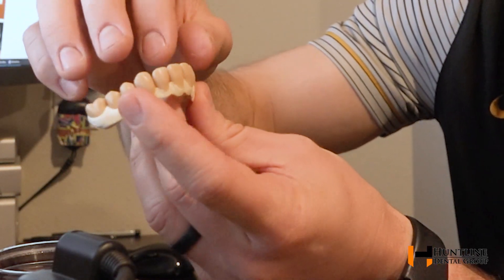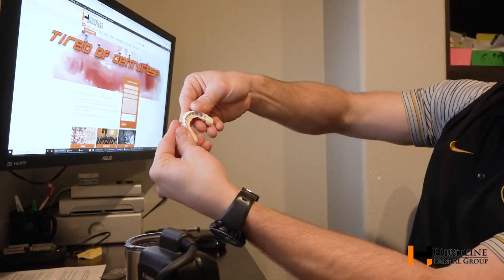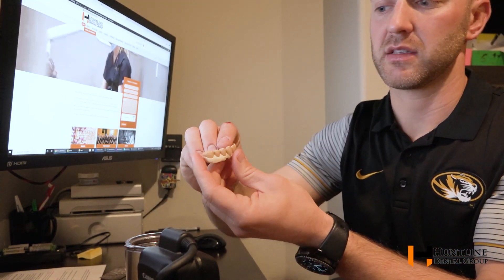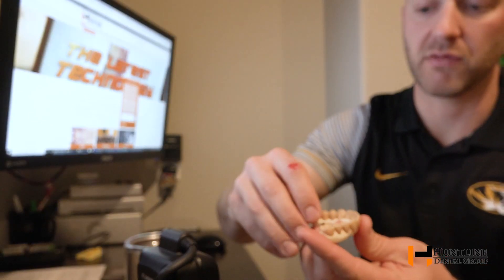We can make you something that is extremely low profile. You can see that shape there — it is not like a denture at all. It can come on and off, or it can be cemented. This gives us the ability to deal with each tooth individually.